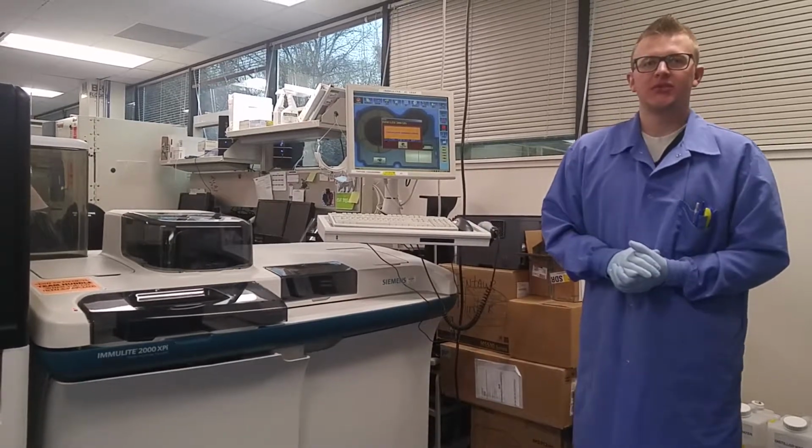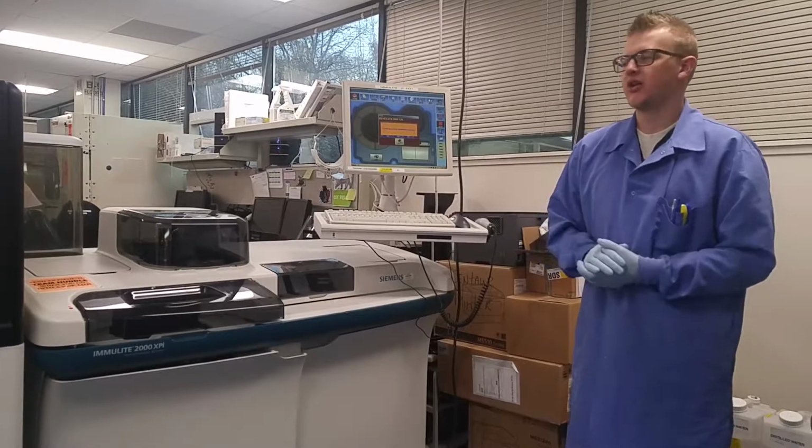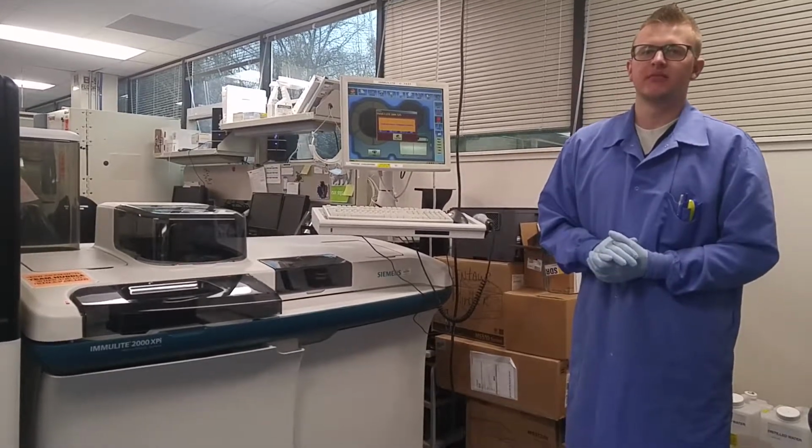Assuming that your levels 1, 2, and 3 all pass within plus or minus 2 standard deviations, you can then resume patient testing.